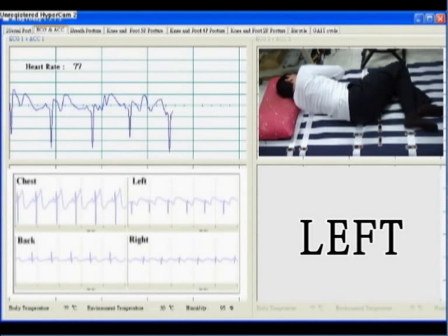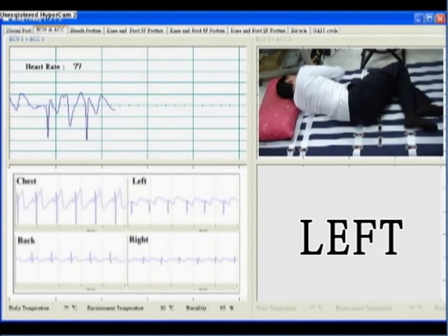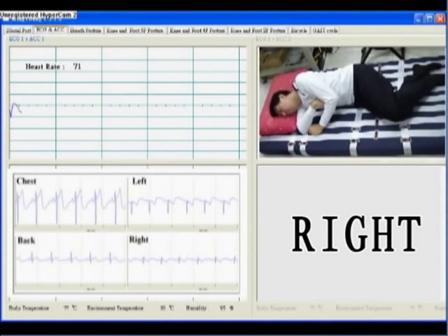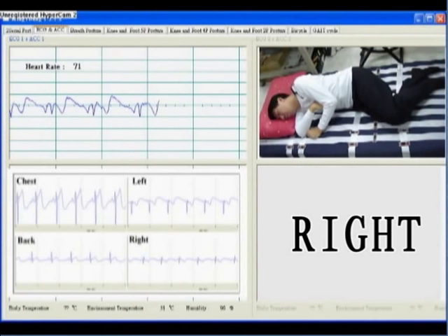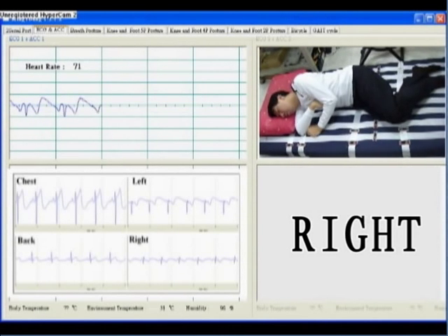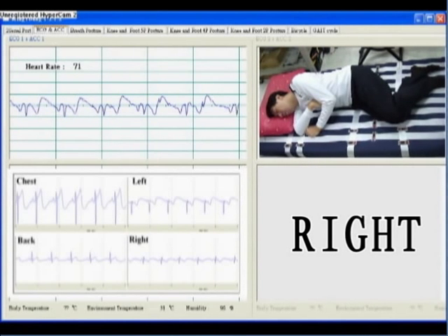Now the subject turns lying on his left, and the pattern of the ECG signal changed. Now the subject turns lying on his right, and the amplitude is the smallest one among all sleeping postures.